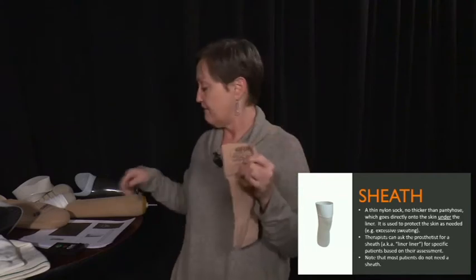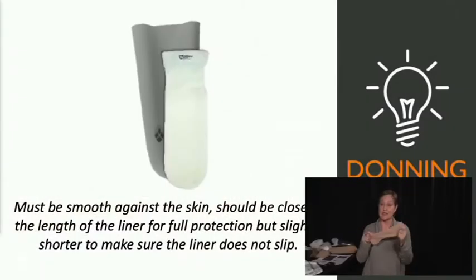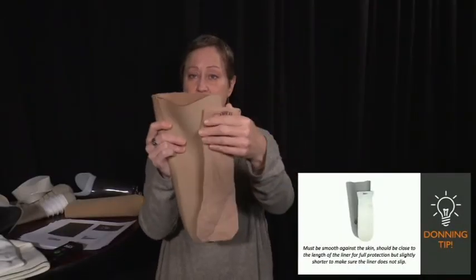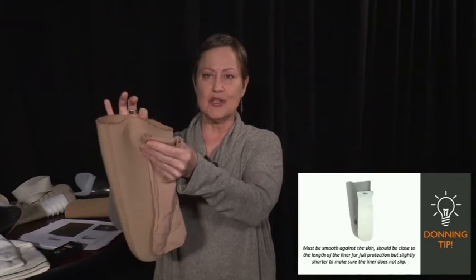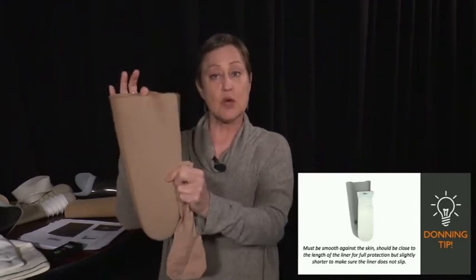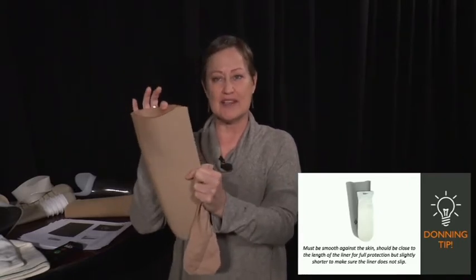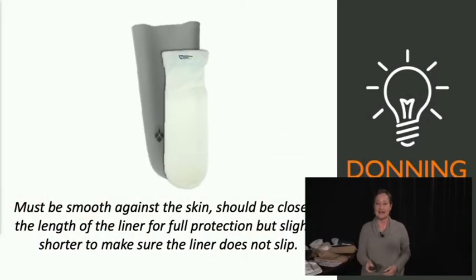The tip that I have for these for donning is, as the slide says, you want it to be smooth against your skin. The other sneaky trick is that you don't want it to come above the top of the liner. You want it to be a little bit below, maybe an inch below the liner. The liner needs to have good purchase on the skin. So if they're not too irritated by doing that, then have it just be a little shorter. And the prosthetist will cut the liner at the appropriate length, which is, you've got a little bit more give for the transtib patients than you do for the transfem patients. So that's what a sheath is.